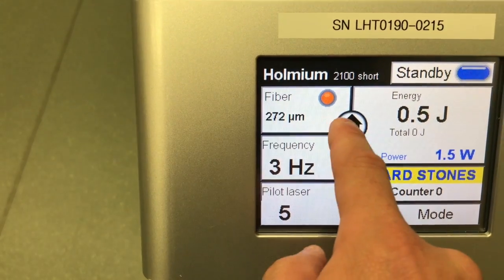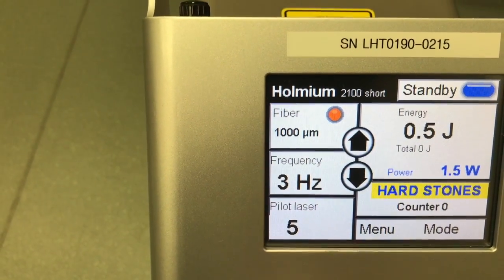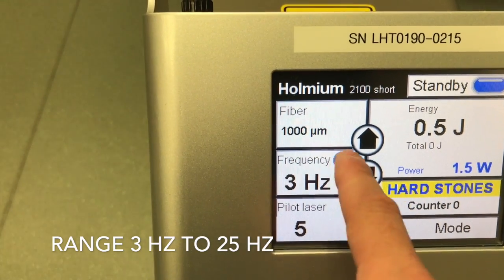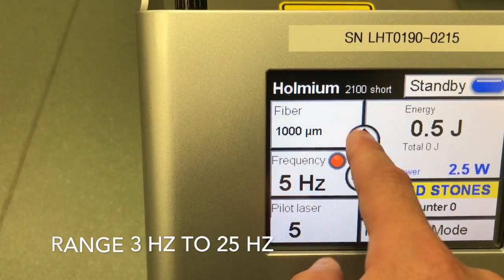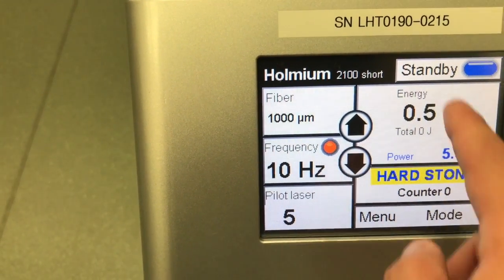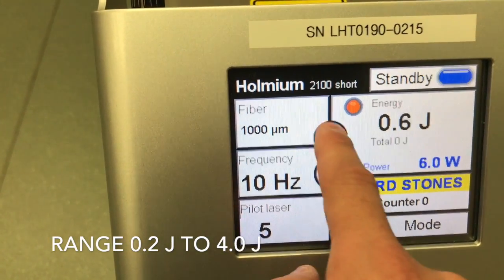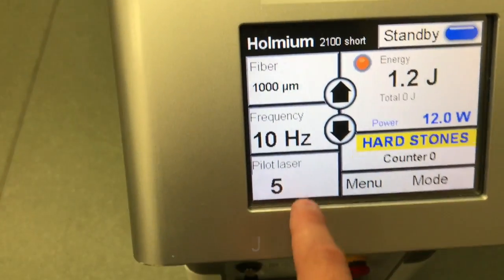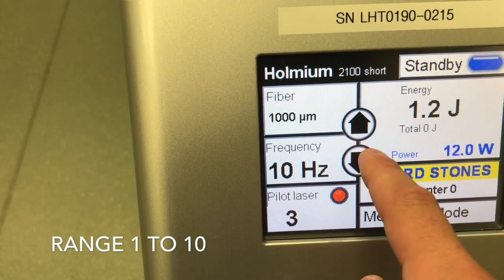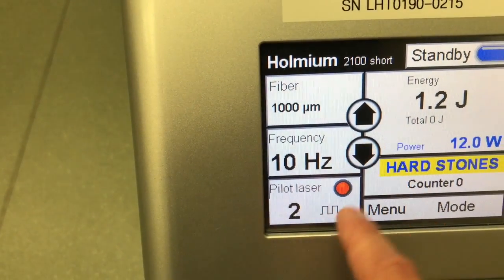For the fiber, if you want to change that, click on it — the up and down arrow allows you to change it. For driver frequency, put the frequency box in; the red dot comes into place and you're allowed to go up and down with the arrow. Energy works the same way with the up and down arrow.